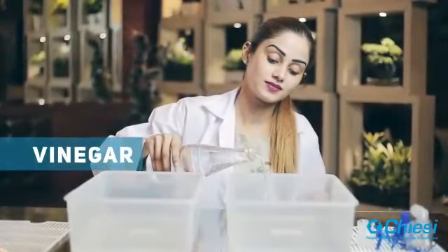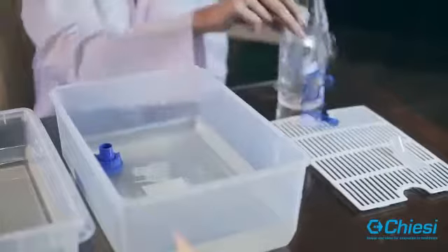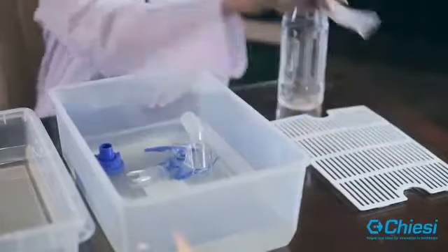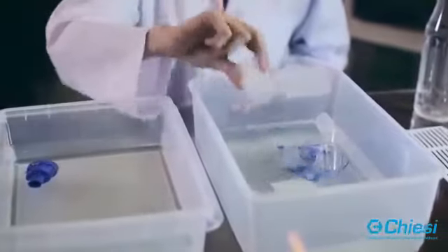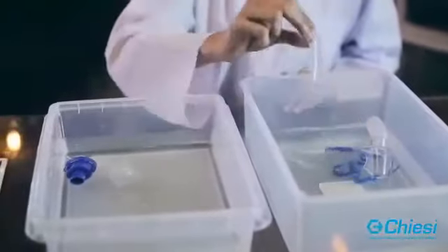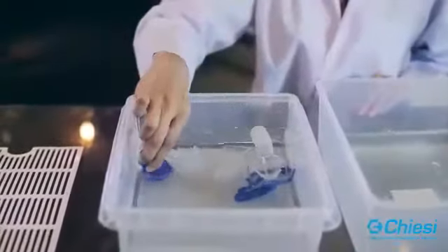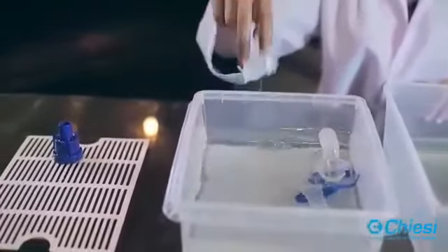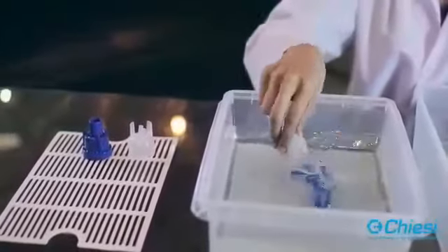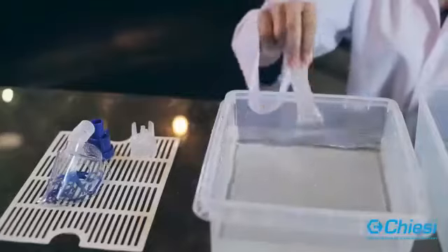Add vinegar in water. Soak all parts of the nebulizer except tubing in a solution of 1 part distilled white vinegar and 3 parts hot water. Remove the parts from the vinegar solution and rinse them in water. Shake off any excess water. After drying all the parts, now you can store your nebulizer in a clean and safe place.